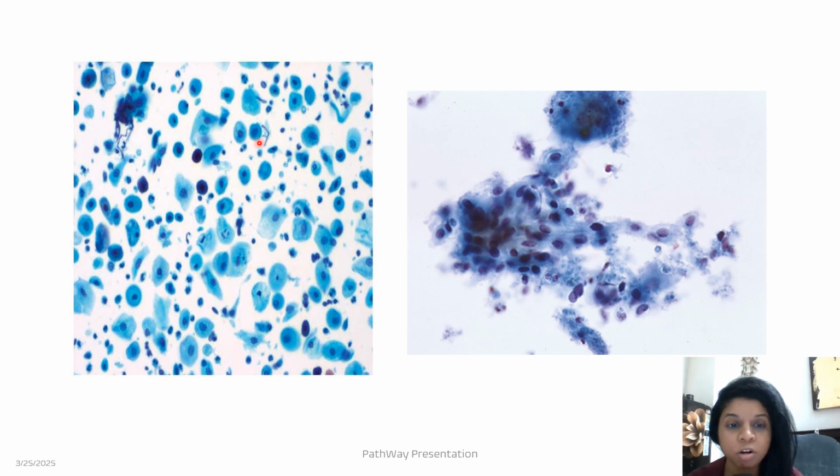So these atrophic cells can be singly dispersed, and sometimes you can see the nucleus disintegrated, karyopyknosis-like, and you can see blue blobs. Blue blobs means blue color, a very dense cell. These are degenerated cells, because in an atrophic smear you can see many degenerated cells where the nucleus or the cytoplasm is degenerated. When it gets degenerated, it will be more blue in color, more basophilic.